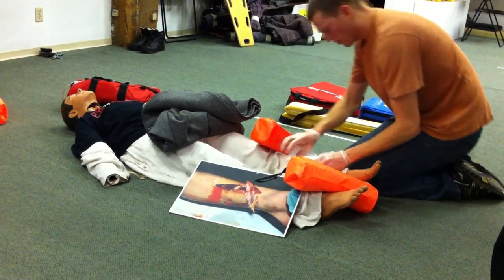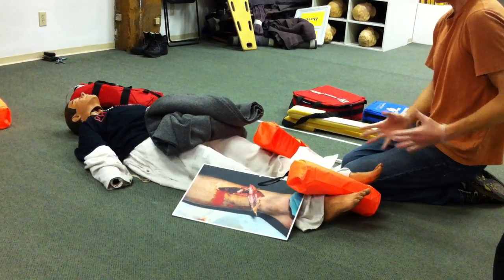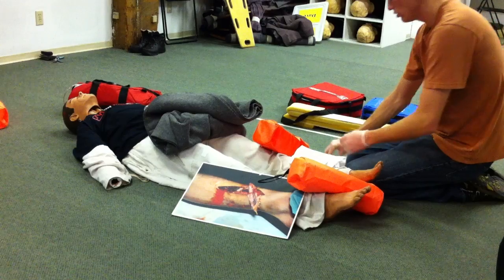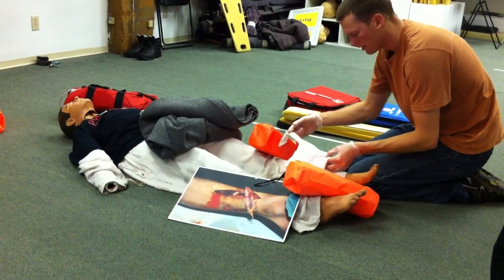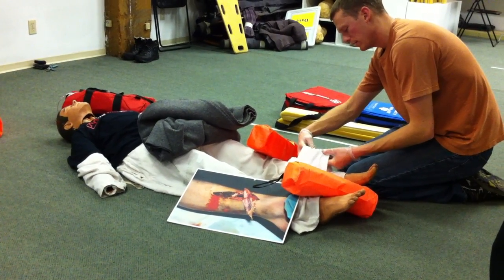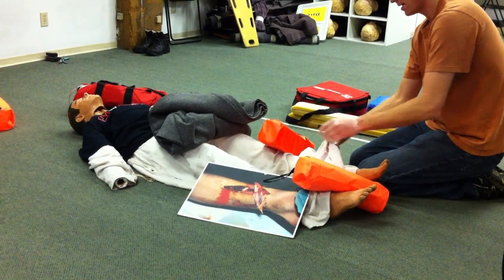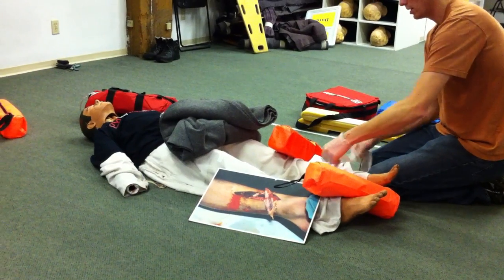Now when I do this, I want to be thinking ahead in that I'm going to have two splints in here. And so I don't want the knots where the splints are going to go, which is unfortunate because of course my injury is up on the top. And if I needed to, and which I would in this scenario, I'm going to put more than one triangular on here. For our demo, we're just going to cheat a little bit for speed. Okay, and then this just gets pulled really loosely on top just to hold it. And then my knot is not going to be where the splints go.